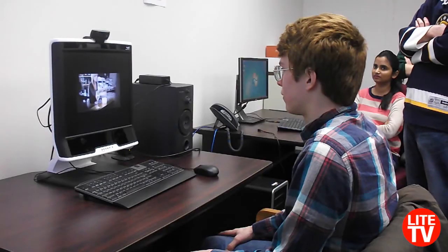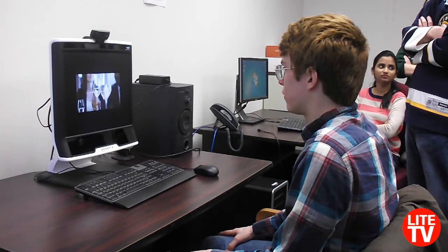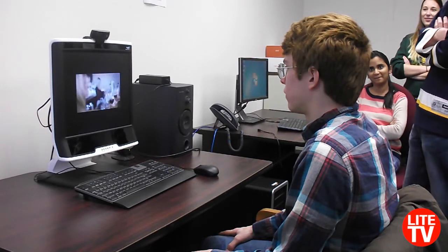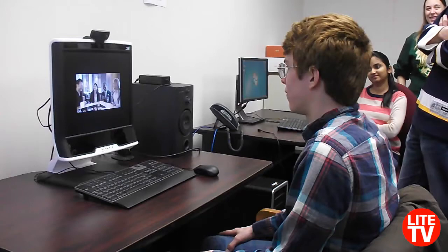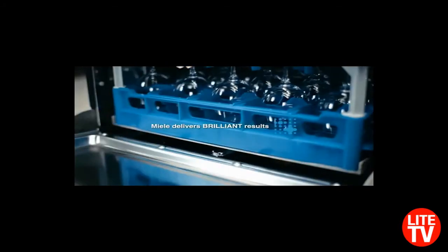Now, based on what you guys are seeing right here, what kind of video clip do you think this might be? An ad? Okay. For what? Alcohol ad? Wine? Looks like it. Those are good guesses, but it's actually for a dishwashing company. But those are all good guesses.